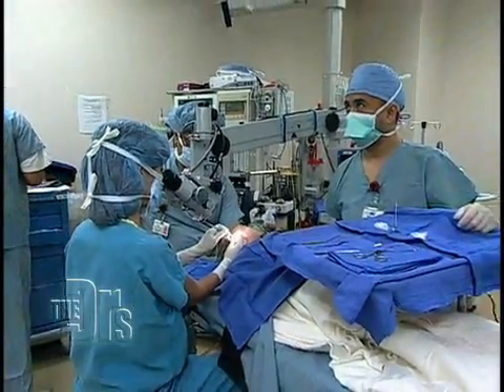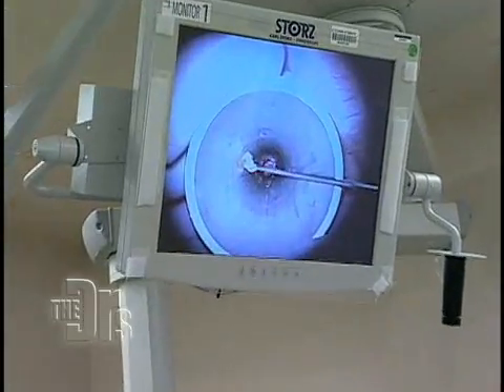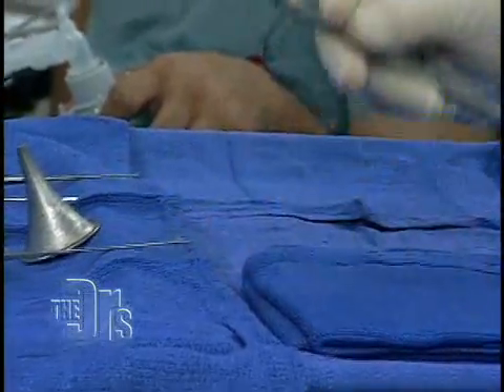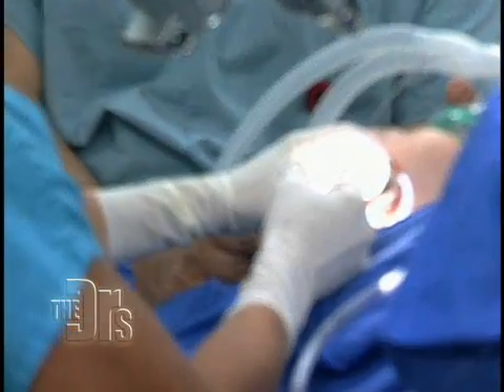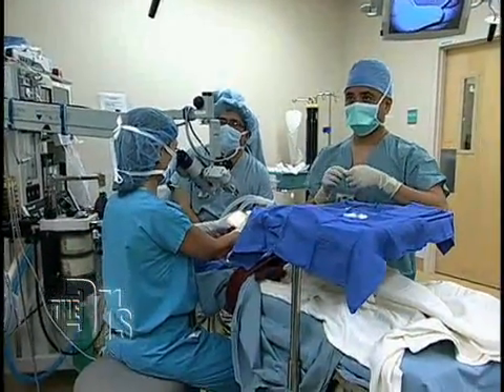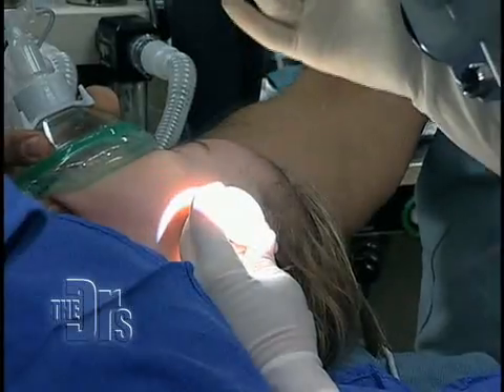So now we're seeing her eardrum and it looks kind of gray. I'm gonna get the ear canal really clean so you can get a good look at the eardrum. Knife, please. This is the blade — the double-edged sword, so you can cut forwards and backwards with this blade. We make a little incision in the eardrum. This is the tube, I'm gonna pop it in. So the tube is sitting in her eardrum right now. You can equalize the pressure. And that's one side. A little suction.